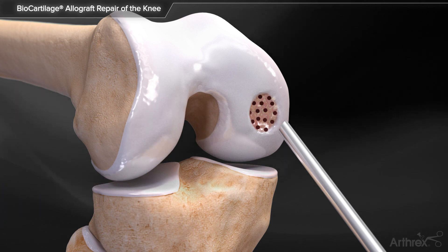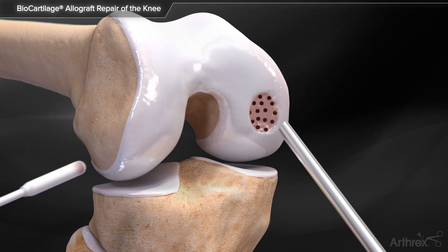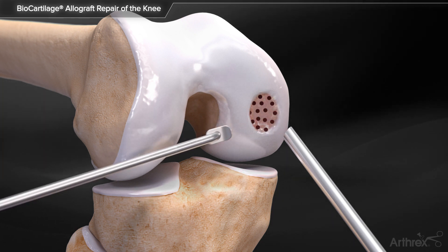Dry the joint and defect thoroughly using suction and the cannulated swabs, then utilize the delivery needle to deliver Biocartilage extracellular matrix into the defect.